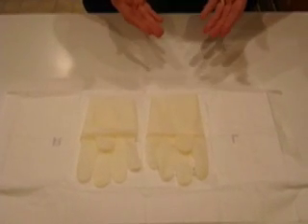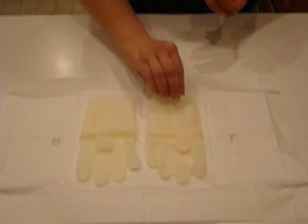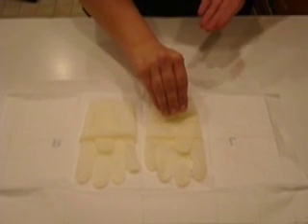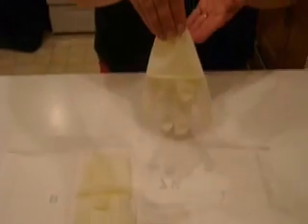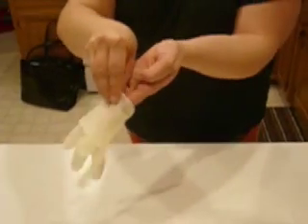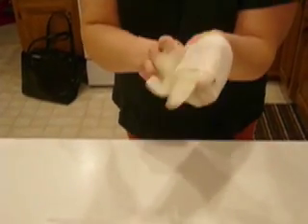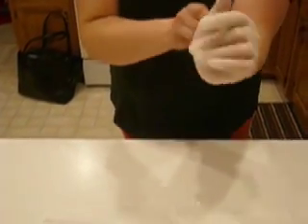The first glove you grab needs clean-to-clean contact, so I'm going to grab the cuff like this, make sure I have it in my hands, come up and away so I don't drag it across the sterile field. I tuck my thumb in to get the glove on, and pull down just using the cuff, then reposition it once to get the cuff where I want it.